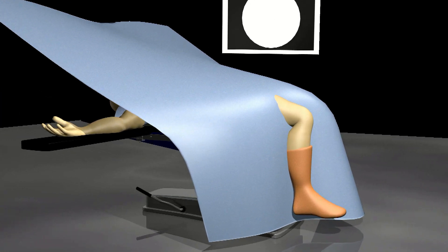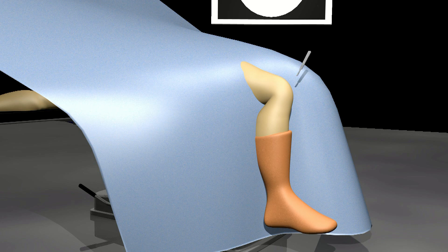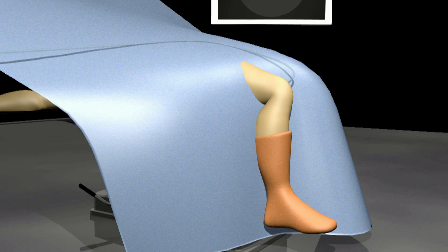A small incision is made in the knee through which a portal is introduced. Through this portal, sterile water is allowed to flow into the knee. This keeps the knee slightly inflated so that the surgeon can see.